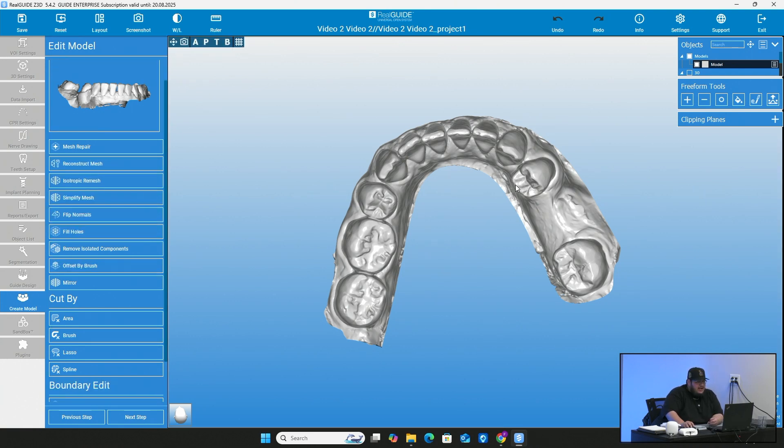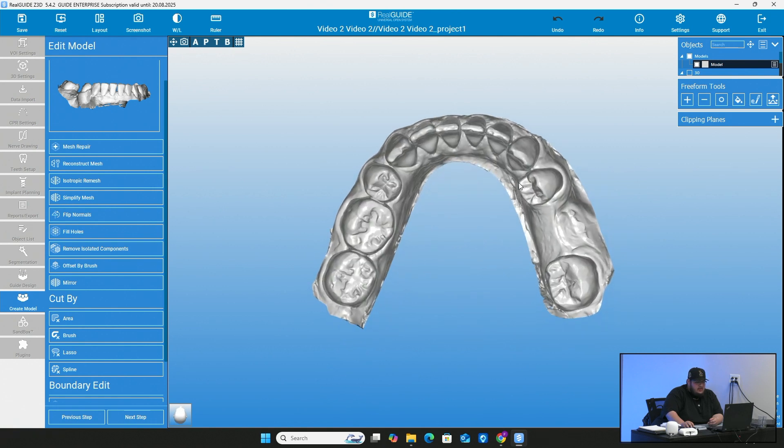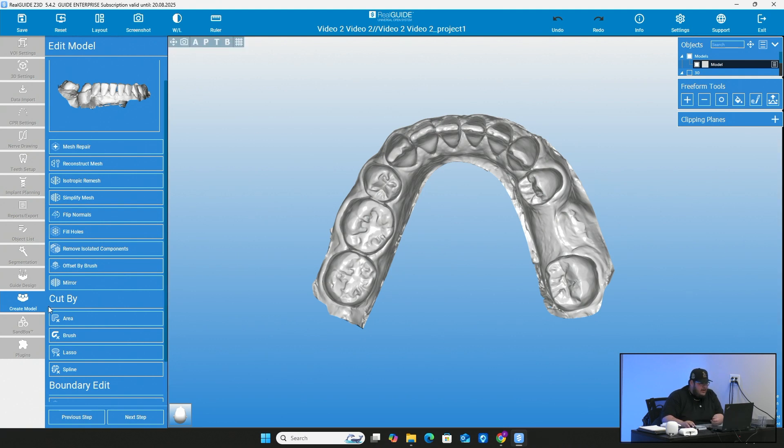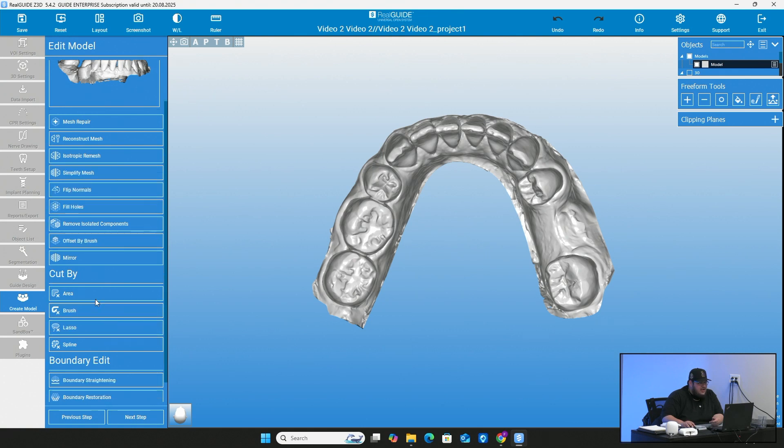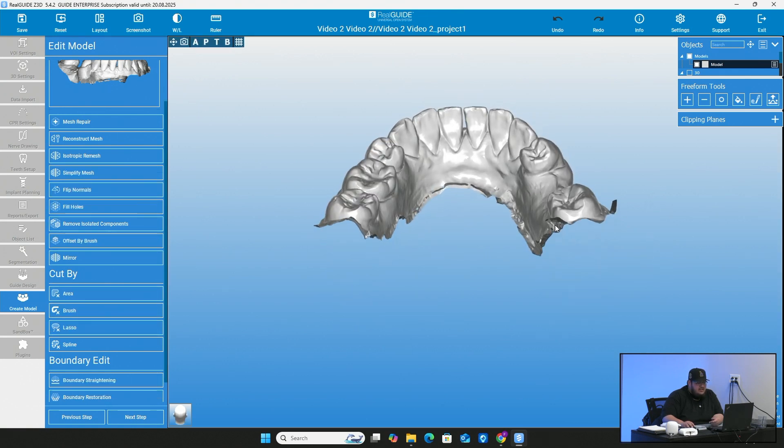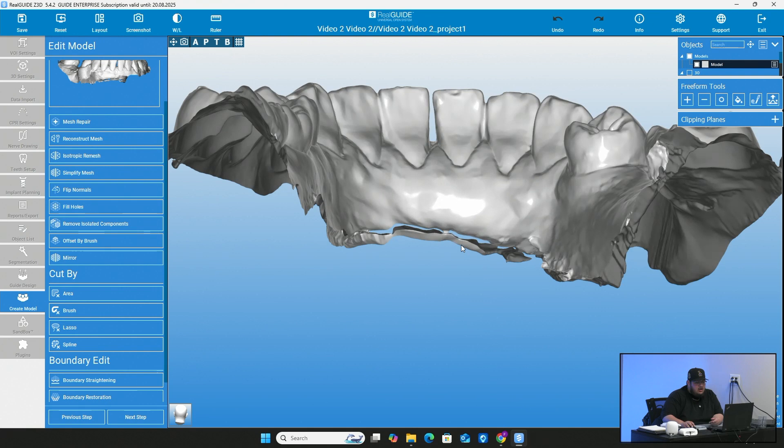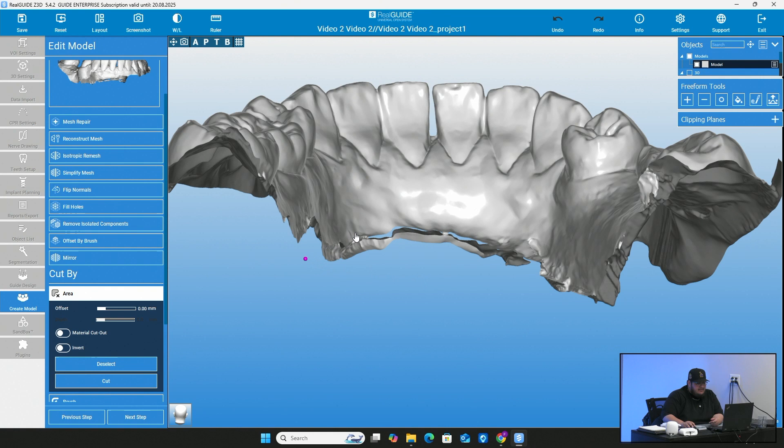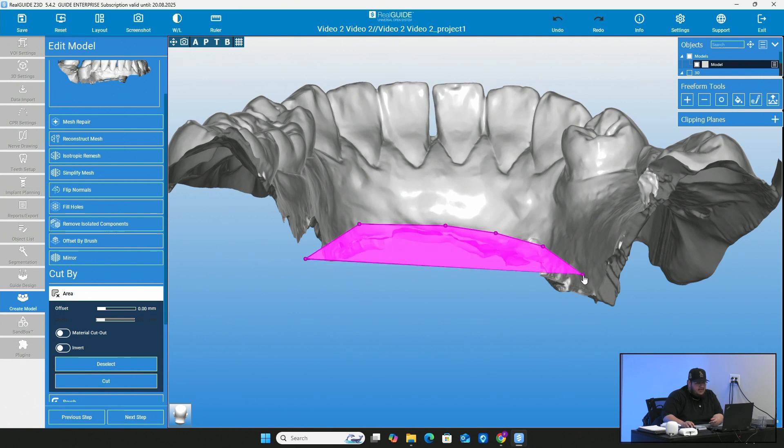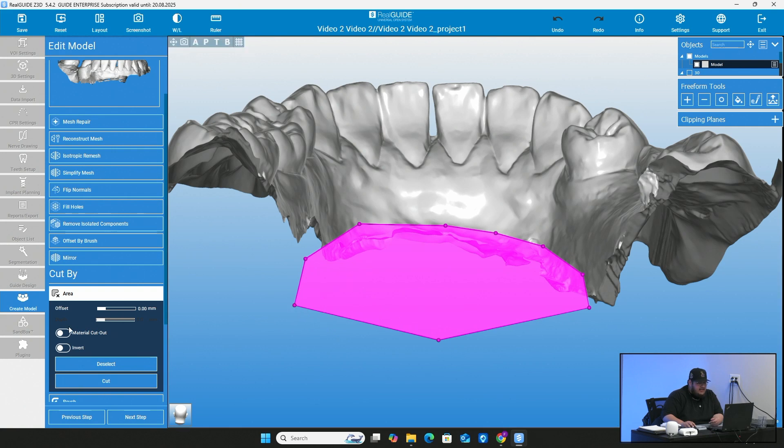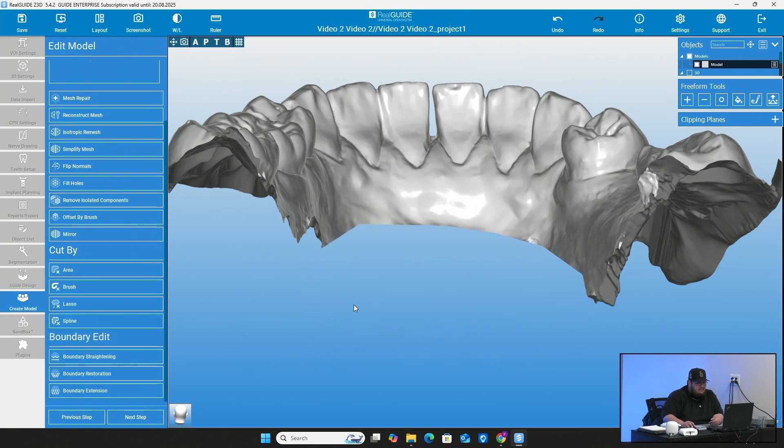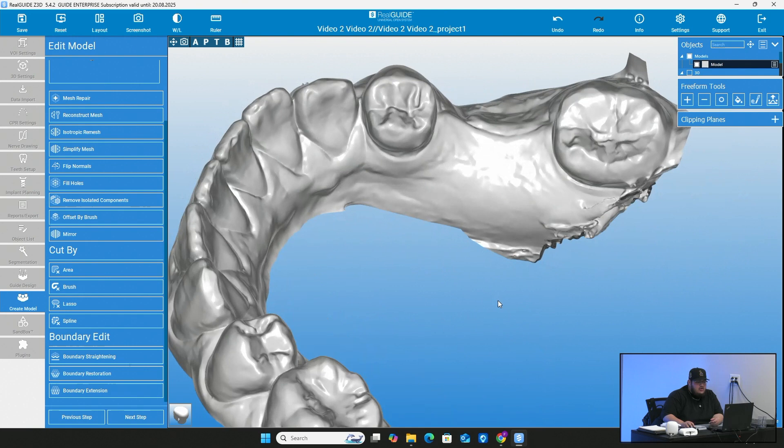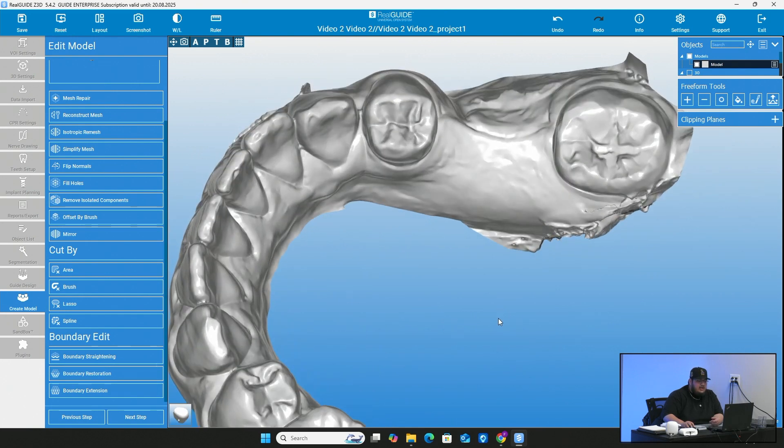Here on the left is going to be just different things that you can do and edit the model before moving forward to actually creating the lab analog hole for you. So right now, as you see, we can flip normal, simplify mesh, cut by. If there's any extra data that you really don't want on this scan, you can go ahead and cut that just by coming right here to cut area and left clicking and creating dots. And whatever is in that pink circle that you see, that's what's going to be deleted.